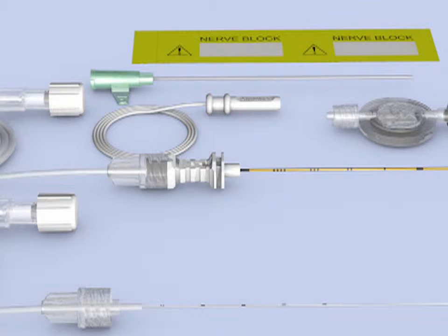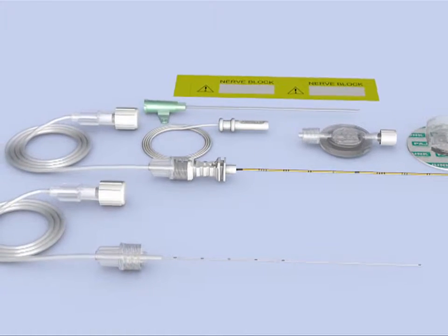Welcome to the Pajunk E-Cath, a revolutionary system for continuous peripheral nerve blockade that makes inserting an indwelling nerve catheter as easy as a single shot technique.